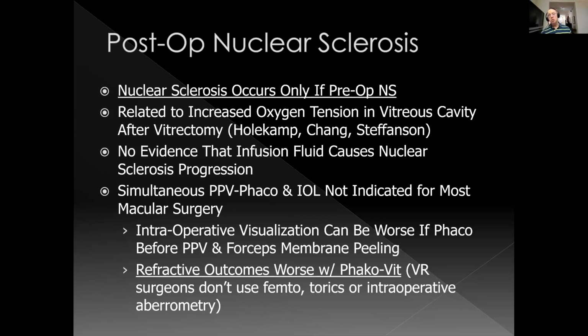If they're going to do the surgery first, you must caution the cataract surgeon to measure the axial length optically with low coherence interferometry from the pigment epithelium. So that means the Haag-Streit Lenstar 900 or the Humphrey IOL Master. You have to use optical means to measure axial length. If there's substantial cataract, of course, you can't do that, and that's another issue.